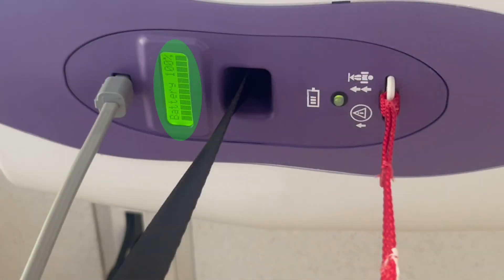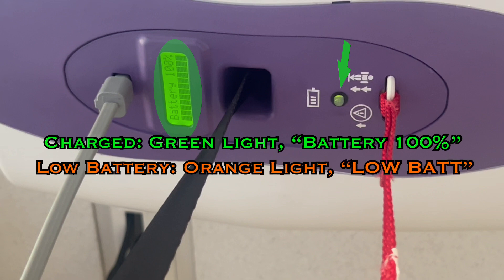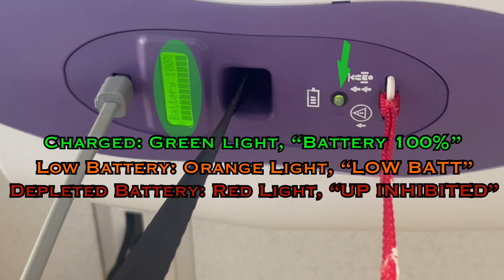There is a small screen that indicates battery life, and an indicator light on the lift that also shows battery status. If the battery is charged and the motor is disconnected from the charging dock, the light should be green and the screen should show a fully or mostly charged battery. If the battery drops below 25%, the light will turn orange, the screen will show a low battery message, and you will hear an intermittent alarm when you raise or lower the lift. If the battery becomes fully depleted, the light will be red, the screen will show 'up-inhibited,' and an alarm will sound any time you try to use the controls. If this happens, it will no longer lift up, but you can still mechanically release the patient to safely lower them to another surface.